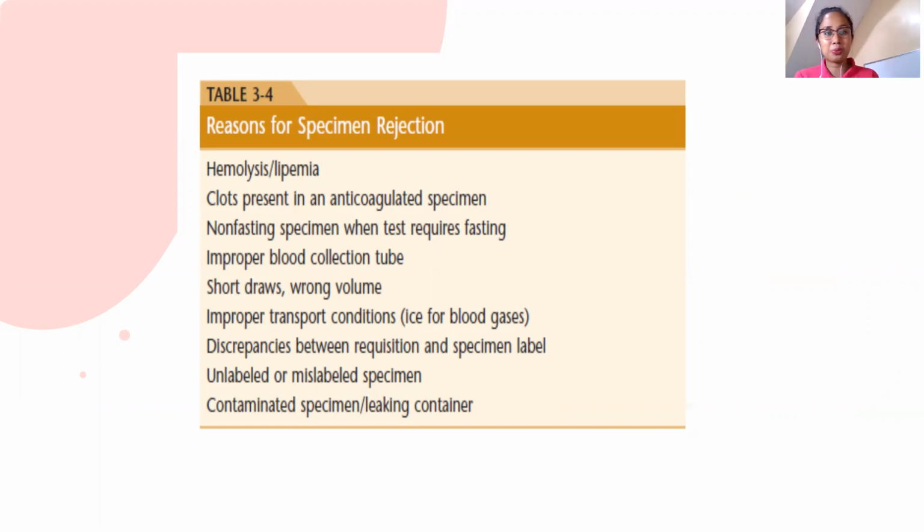Hindi mo itatapon yung specimen. You have to confirm kung sinong gumawa nun. Yan, sinong gumawa nun, ganyan. You have to settle the discrepancies. We have unlabeled or mislabeled specimen ako. Contaminated specimen or leaking container. Alanganin tong mga to. Yan.